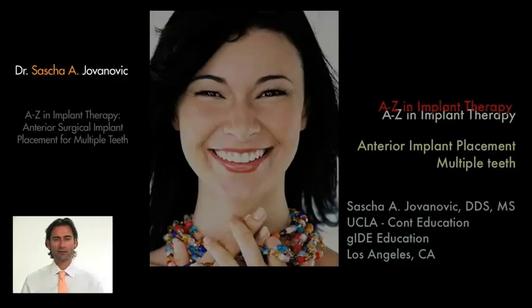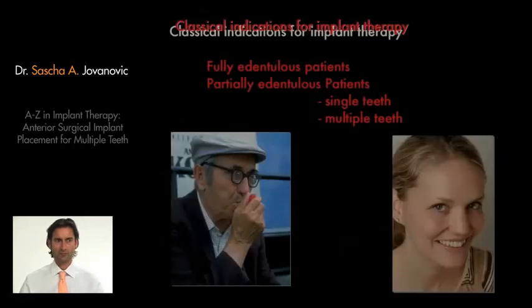Today's lecture will be concentrating on anterior implant placement and specifically on multiple teeth, which from a surgical, from a restorative, as well as from a biological standpoint has considerations which we have to follow. This lecture will follow nicely the lecture which has been recorded on anterior implant placement for single teeth. Now, first of all, we look at the classical indications.